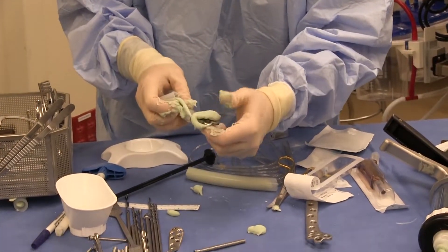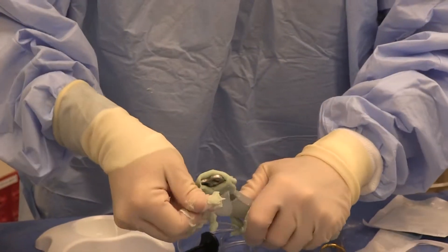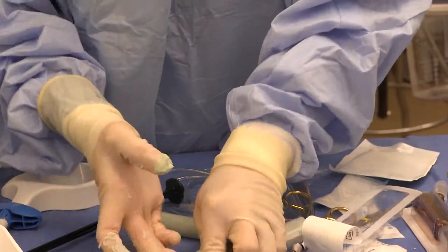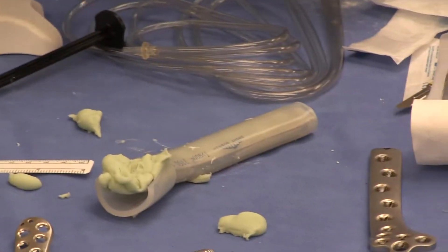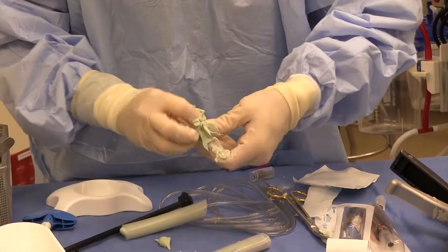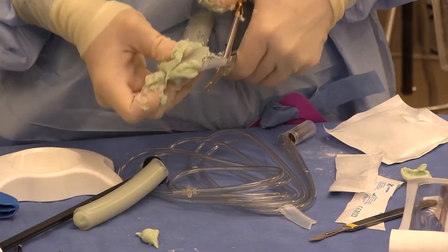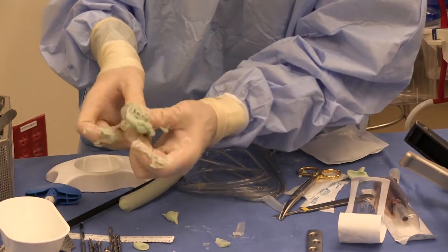It's not awesome, because I don't have a great piece of tubing that will go over this bottom part, but I can at least use the silicone to kind of make it flat and mold it. Not ideal, but the best we've got right here. Let me see if I can get another piece and cut it for the top, because the silicone is nice — it doesn't really stick to the cement at all — and I can even use a clamp to hold this down to get a more uniform coating.